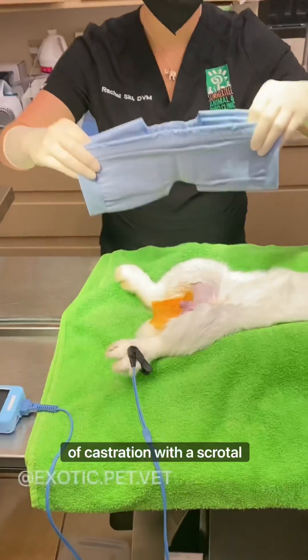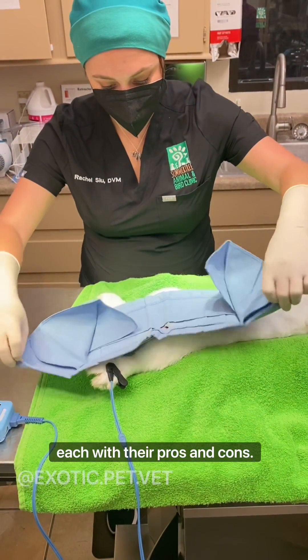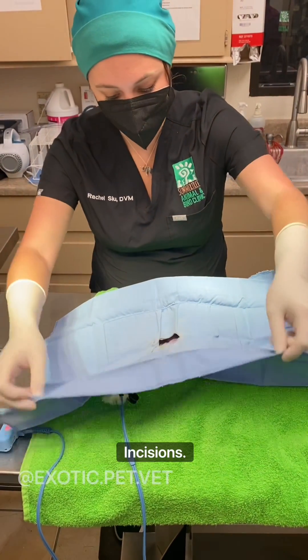Here I am performing a closed method of castration with a scrotal approach, however there are multiple other ways each with their pros and cons. Some prefer an open castration while some perform pre-scrotal incisions.